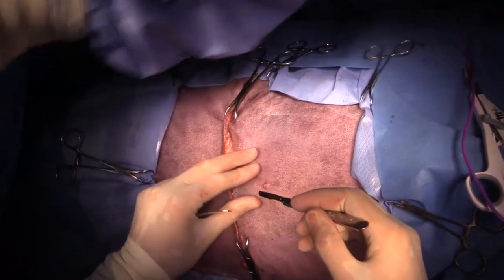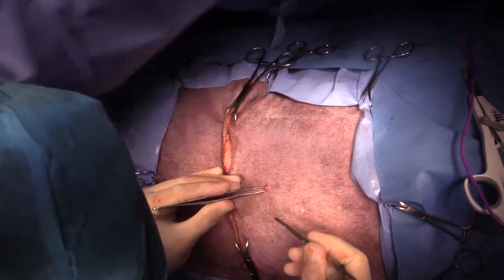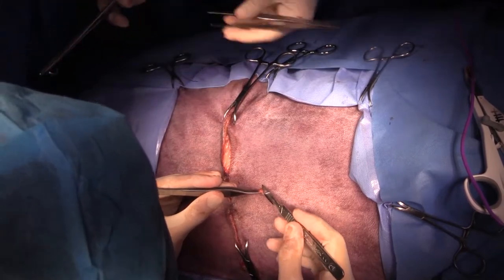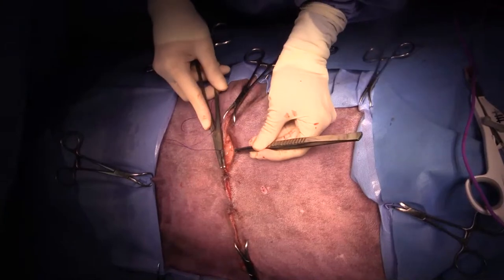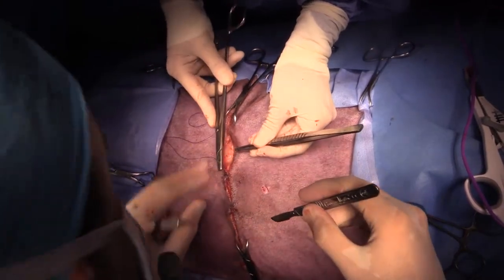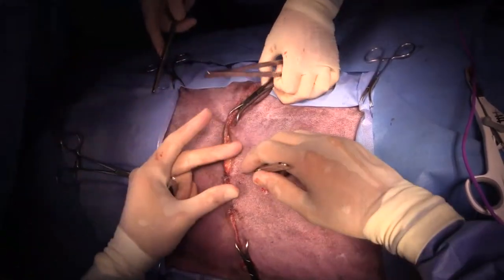So the first one, just cut off this little papilloma. That's out of the way. Now I'm going to make my Z. Where's the top of my incision? Up here and down here. So I'm going to go right down the middle.